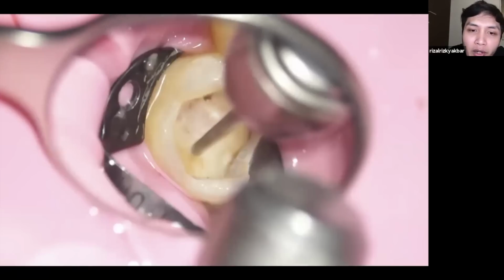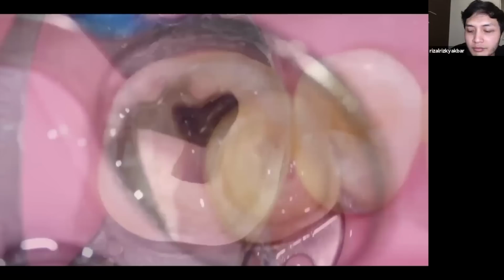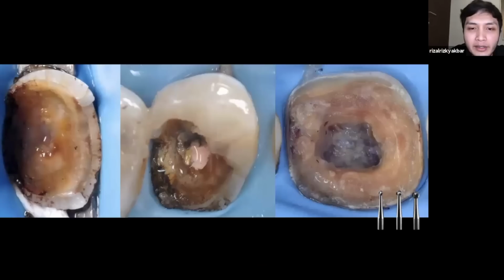Yeah, the old one. Bone cutting burr is just a simple burr that you always use for doing odontectomy or doing surgery. So as you can see here, the cavity is clean and ready to do build up or proximal wall or something. Yeah, this is the example of another case where I use carbide here and bone cutting burr.